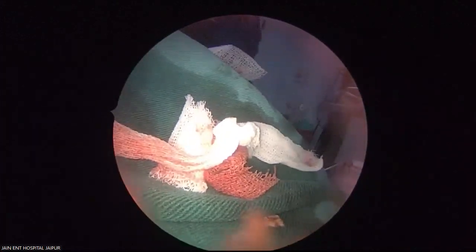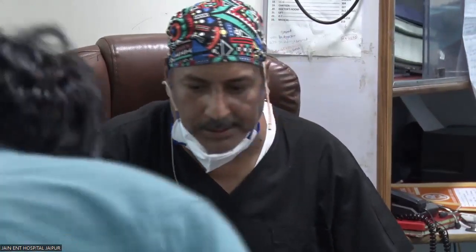I know. See, anybody can do this who is doing endoscopic work. We have to follow the principles of endoscopic surgery. And in JNA, we have to follow all principles of exposure, taking vascularity and control, and use of coagulator. And we should respect all the landmarks before destroying any of them. And then we should first deliver the tumor and then take care of the other areas.